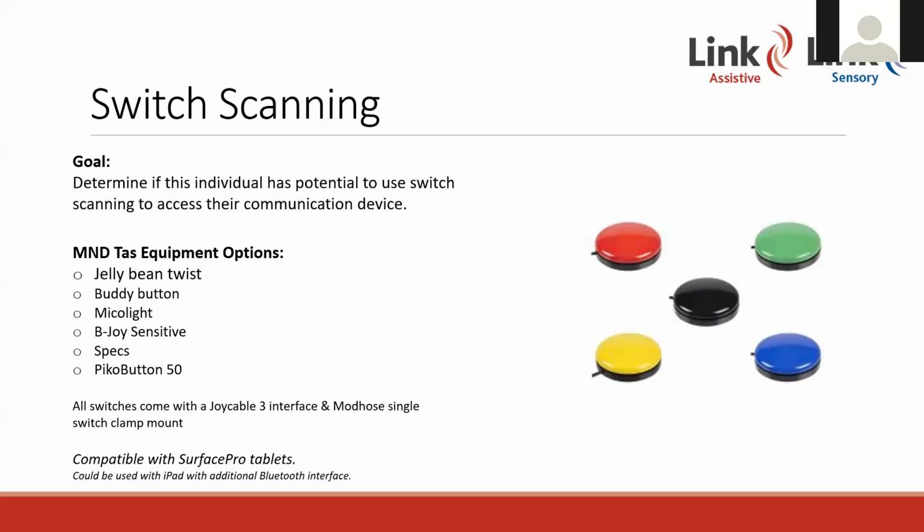So that's what will be most easily available. You can also use switch access with an iPad if the person has an alternative Bluetooth interface that's compatible with iPad. So you can switch access an iPad, but you'd need an extra accessory if you were looking at options available just within your equipment loan pool.